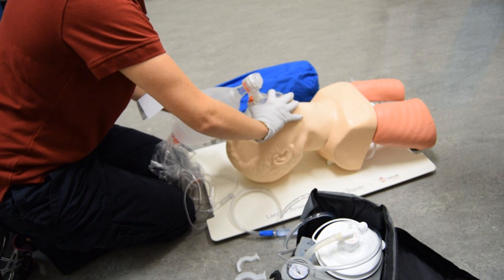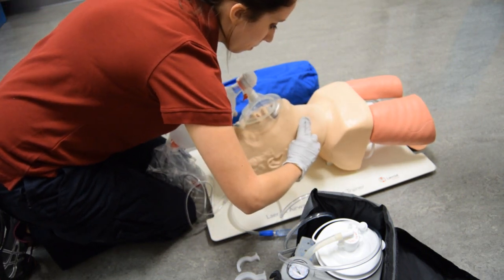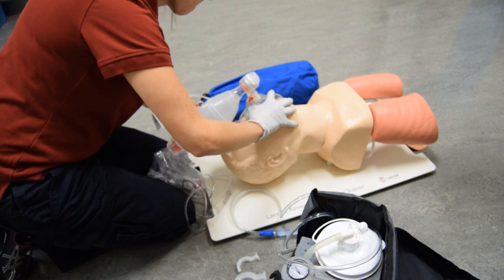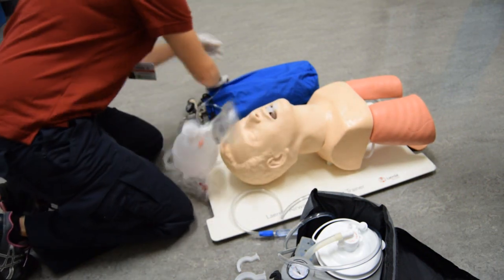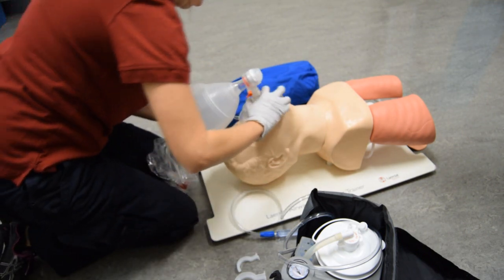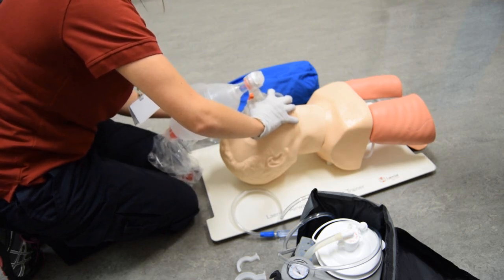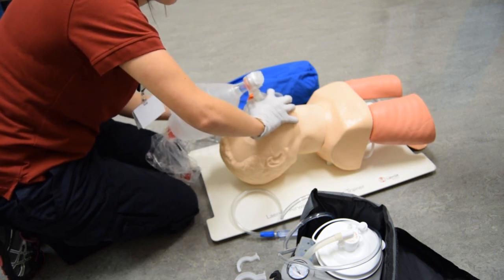The student rechecks pulse for at least five but no more than ten seconds. The student will attach the BVM to oxygen. Ventilates the patient adequately, looking for proper volume to make chest rise, proper rate 10 to 12 per minute.